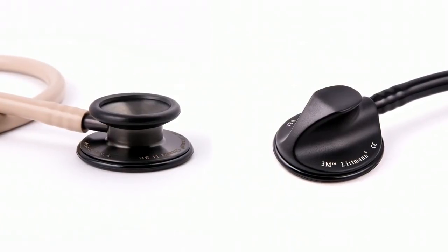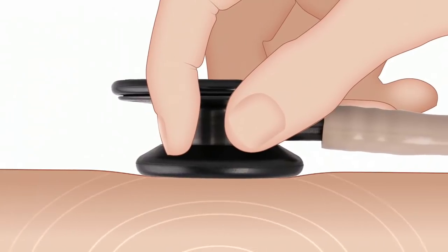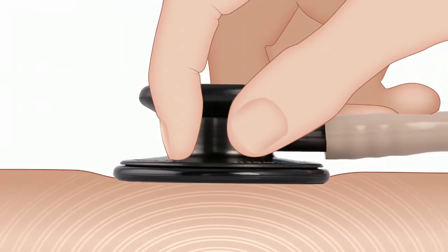There are two types of Littmann chest pieces, double-sided and single-sided. With the double-sided chest piece, use the open bell on the small side to listen to low-frequency sounds and the diaphragm on the large side for high-frequency sounds.